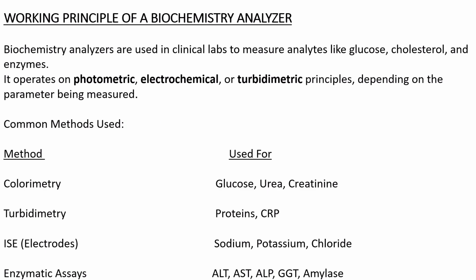Some high-end analyzers also use nephelometry, which is based on the principle of scattering of light at an angle from the particles that are present in the suspension. It could be employed for CRP, ASO, RA factor, or any other reactions where there is an agglutination of the particles.